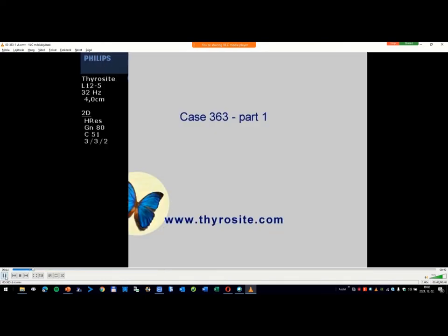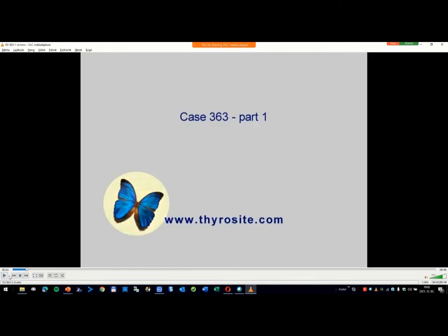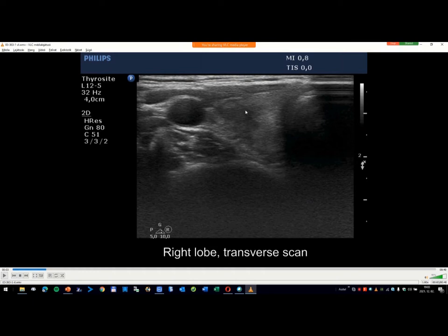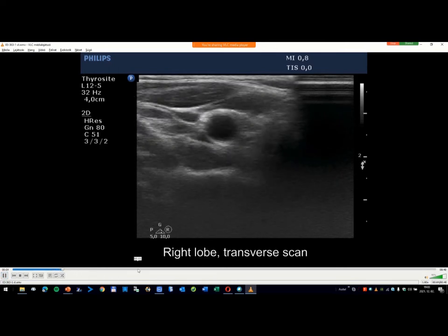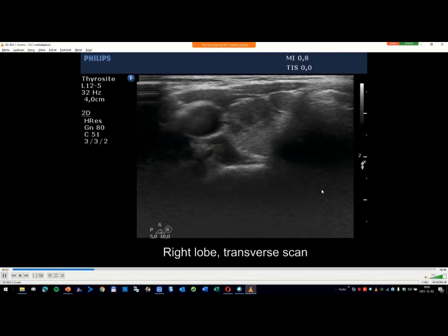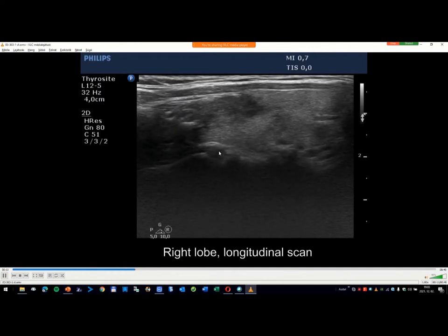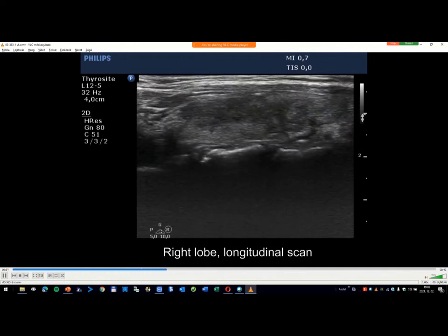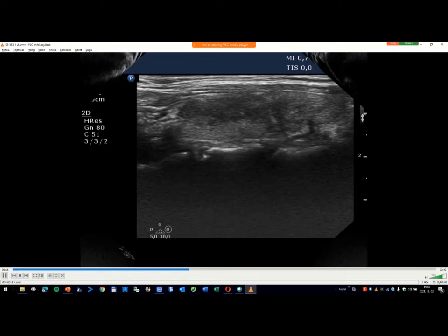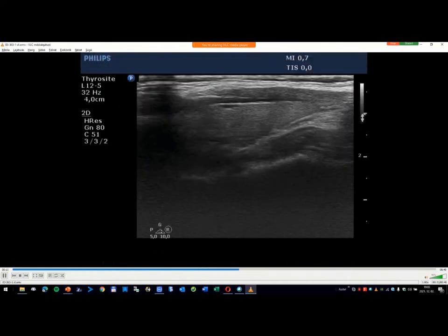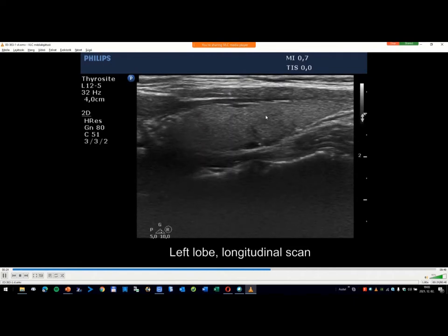But if we see the transverse view, this one, a papillary cancer could present in this form. The transverse scan is almost always inferior to the longitudinal scan because a much greater part of a lesion is presented in the longitudinal scan.